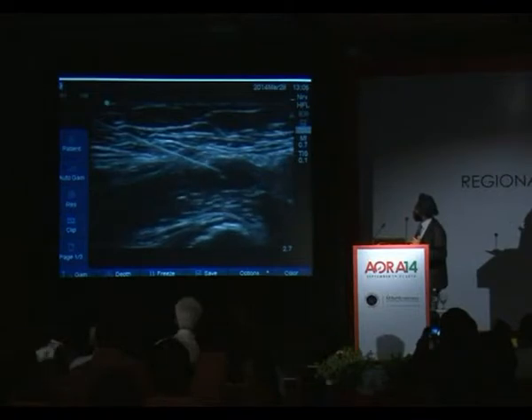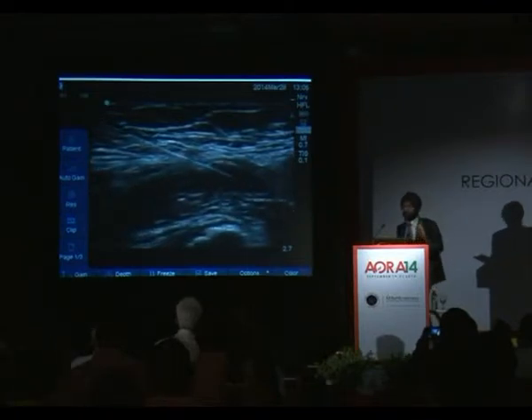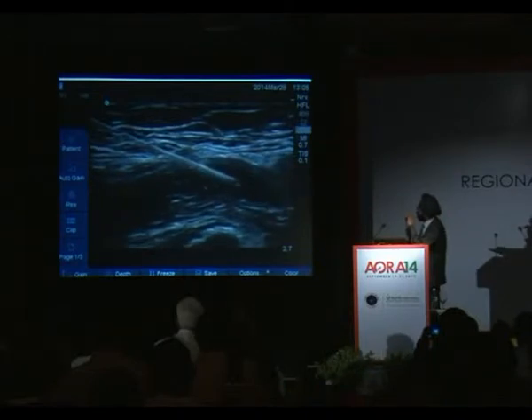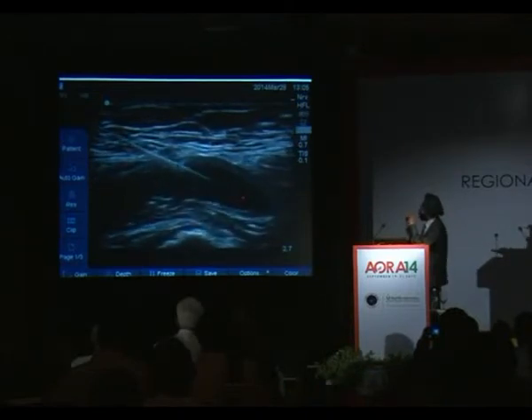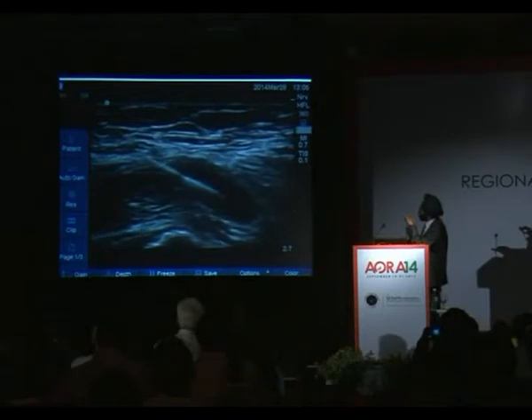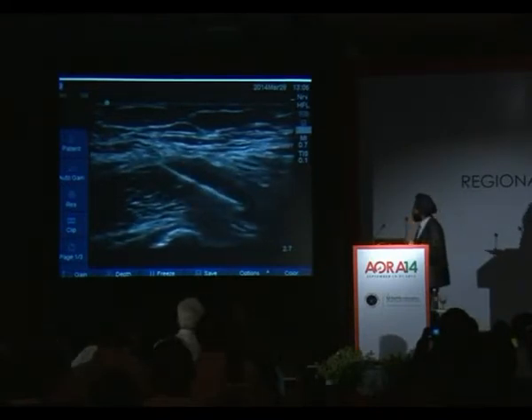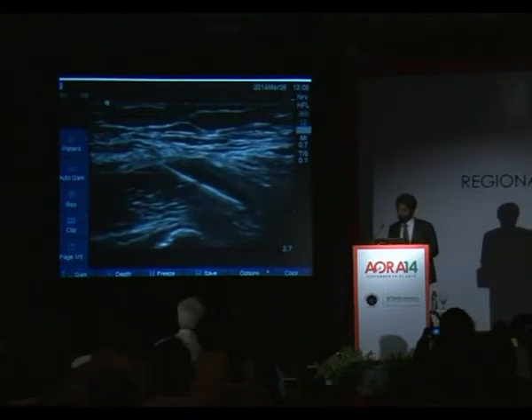With just 1 mL of local anesthetic, you can see we have just peeled away the iliacus muscle from its overlying fascia. So there are just two tricks with this block. Get your needle through sartorius, and while we are putting more and more local anesthetic, it is spreading down. Keep your needle tip always in view and in the lens of local anesthetic. And we can see the local anesthetic moving down towards the pelvic cavity. Again, I would use about 40 mL of 0.25% Marcaine.